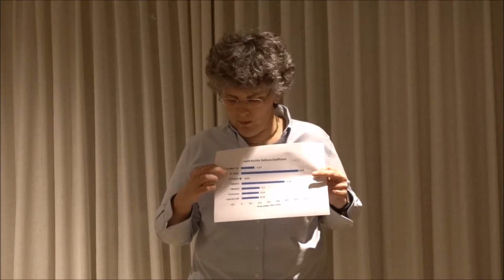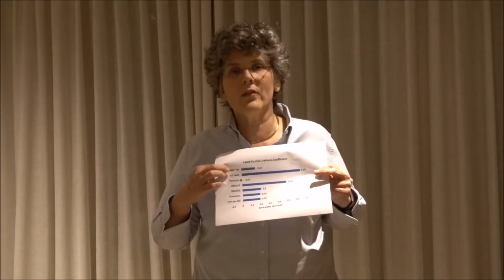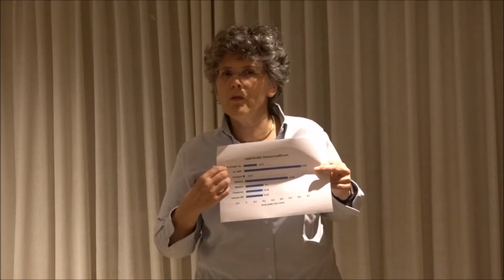Now we can also look at a very old bifocal IOL, the AT366D. It was a bifocal IOL with a very near addition point, and you can see that in terms of the defocus coefficient it's quite high. It's the highest in this graph. This means that it has the lowest defocus functionality.